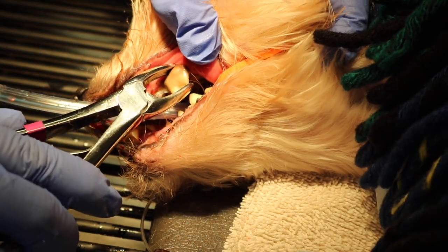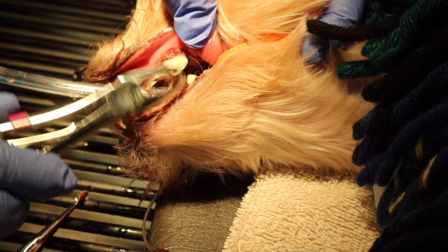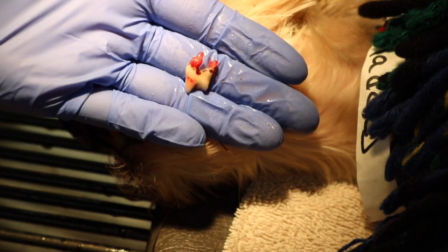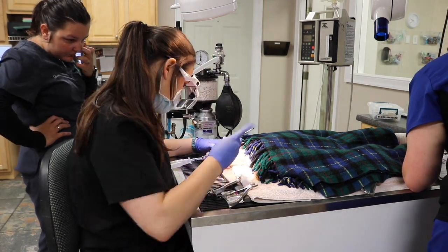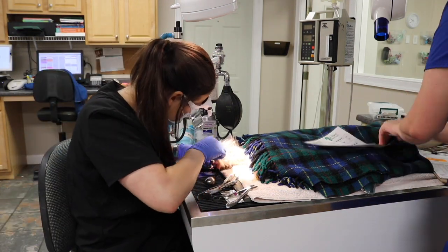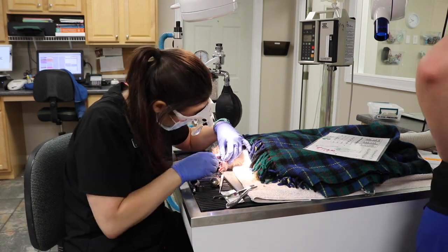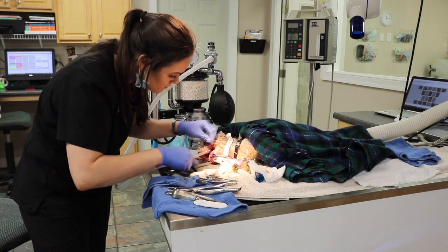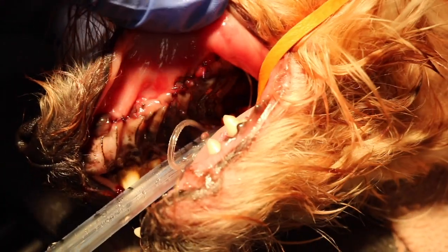So this is gonna look like I just fractured the tooth in half, but I didn't. That giant chunk I just cracked off was a chunk of tartar — that was the only thing holding this dog's tooth in its mouth. Once I got all of the infection cleaned out of his mouth and got rid of all the non-viable teeth, I went through and flushed everything with some Chlorhex rinse. I also applied a synthetic bone graft to where all of the teeth were pulled, just to help regrow the jaw. Then I went through and sutured everything closed. I did recommend to his owner to come back in a couple months so we can re-radiograph his jaw, and hopefully his bone has started to regrow.